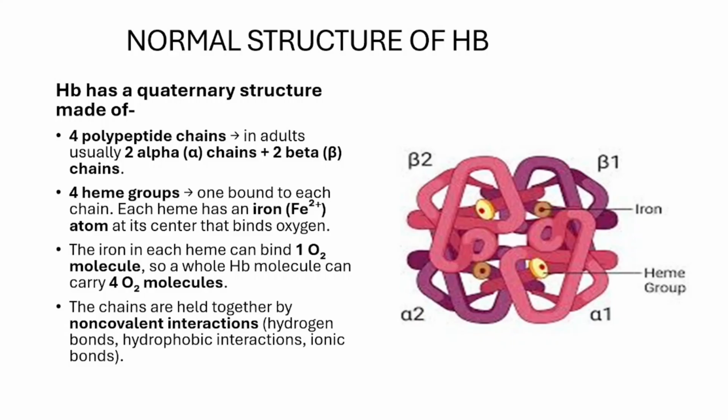In today's section, we are diving into a very important diagnostic tool in hematology, Hb electrophoresis. Have you ever wondered how doctors detect abnormal hemoglobin like hemoglobin S, hemoglobin C or thalassemia? Or how we can separate different types of hemoglobin based on their electrical charge and size? Well, that's exactly what Hb electrophoresis helps us to do.